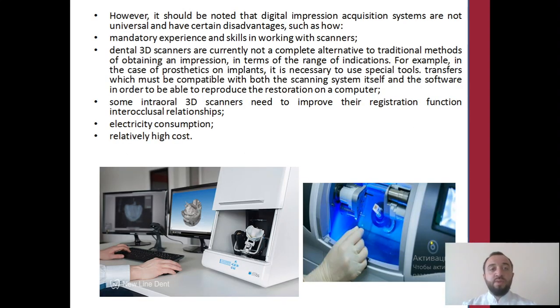However, it should be noted that digital impression systems are not universal and have certain disadvantages, such as mandatory experience and skill in working with scanners. Dental 3D scanners are currently not a complete alternative to traditional methods of obtaining an impression in terms of the range of indications.